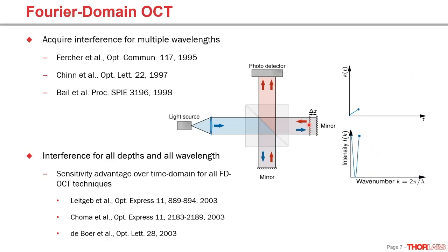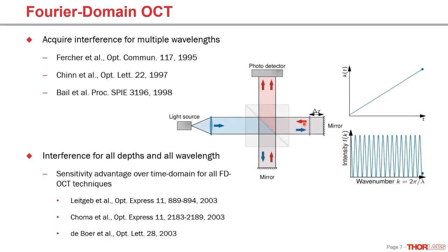So if, for example, this distance from going to the mirror and back is 10 wavelengths, and you change the wavelength by 1/10 of a wavelength, you will again have constructive interference, because now instead of 10, 11 wavelengths fit in there, but in the meantime, we will also observe destructive interference. And of course, if you increase this distance to 100 wavelengths difference, you only need to change the wavelength by 1/100 of a wavelength to get once through this cycle of destructive and constructive interference.